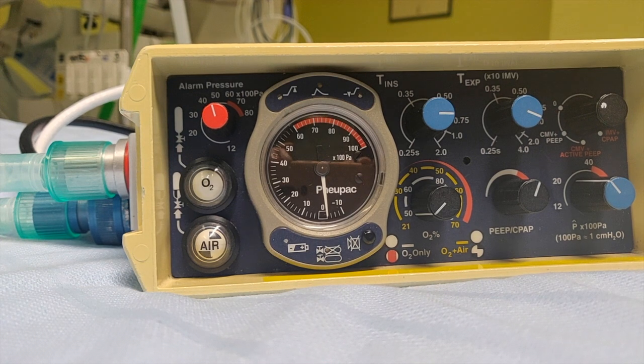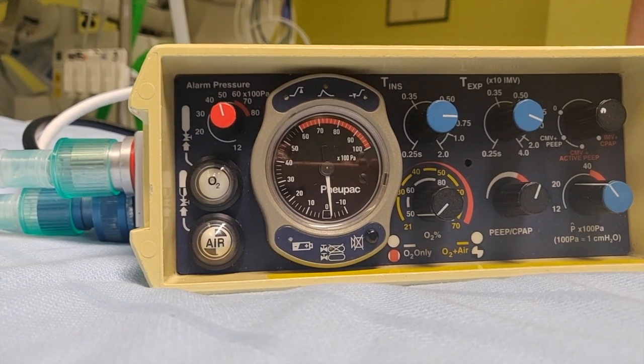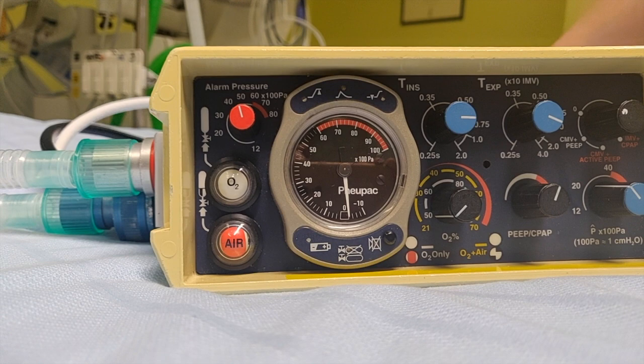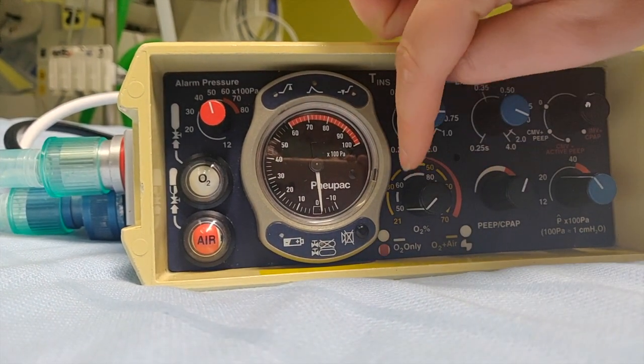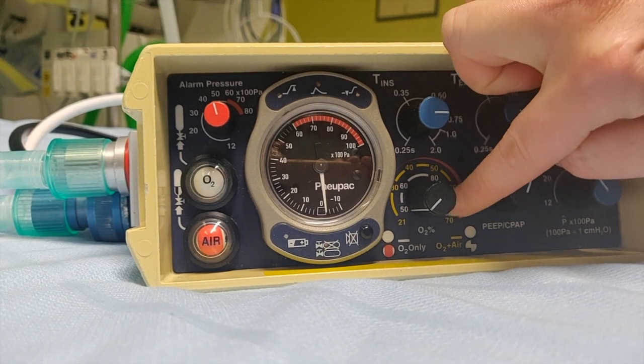If we disconnect the air — which I'm going to do now — it goes red, and then our dial goes from 50 to 100.